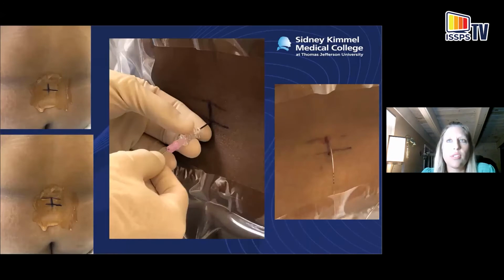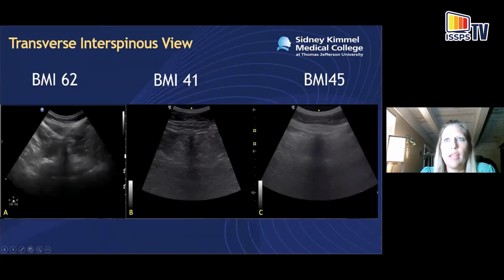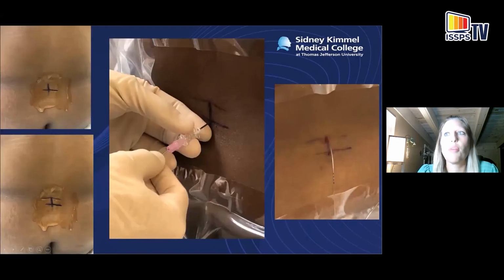And so this was the patient from the previous scans. You can see we ended up marking our interspaces, and we went at the location of the marks, and we actually got the epidural here, but we ended up getting some blood back, so we moved to the next level. So that's why it's important to do more than one level, because you never know when you're going to run into problems. And we can see we have a successful epidural placement in this obese patient.